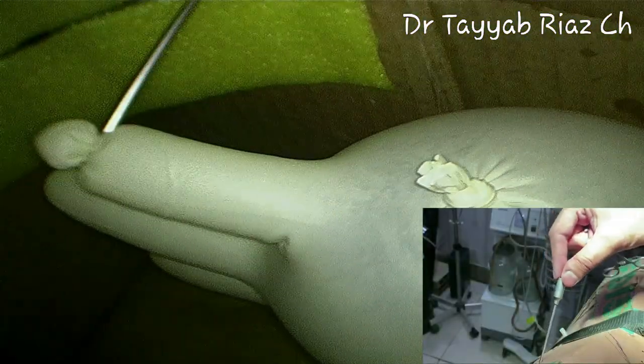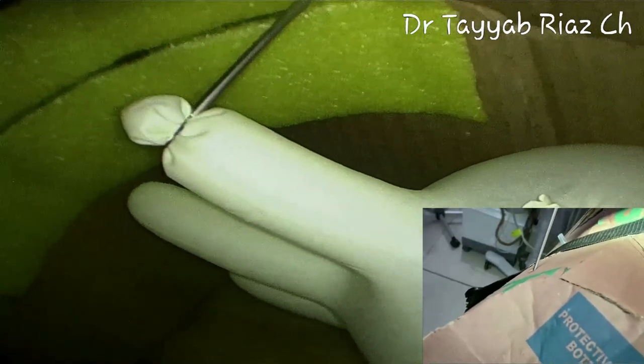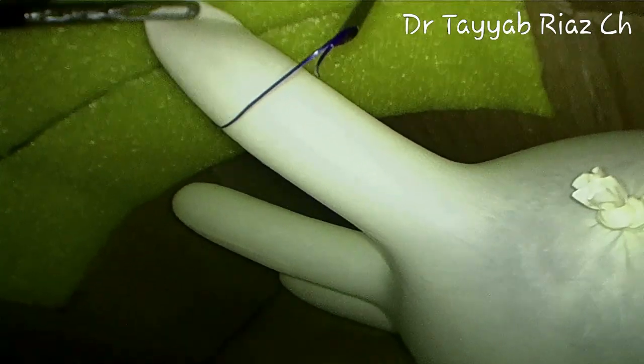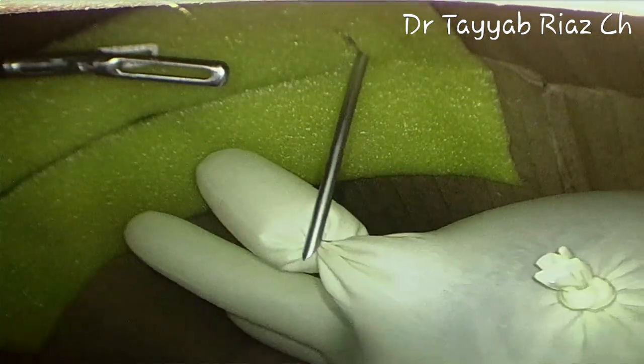Now check out the freedom of movement of this Veress needle. You can manipulate the tip of the appendix in any direction easily and can work on the mesoappendix for dissection either with the help of ligature or can tie it with the extracorporeal knot. And if the appendix is long, you can also loosen this loop and hold the appendix further proximally for easy handling and manipulation. And when your job is done, remove this loop and bring it out from the Veress needle.